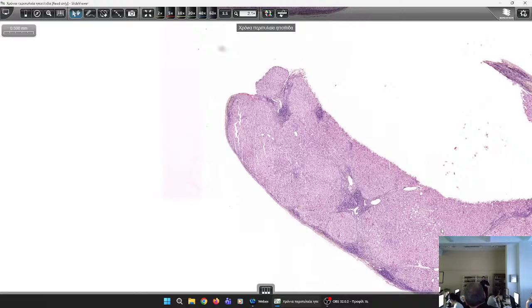You see that the nodules are... Come closer, Alexandros, so that they can see the microphone. Okay, so you can see that the nodules are already circular in shape, which means that they are regenerative. You are in that phase. And you can see that hepatitis is active. The offending agent is still there. It's a procedure that is ongoing. And if it's not dealt with, it will end up as a full-blown cirrhosis in the end.